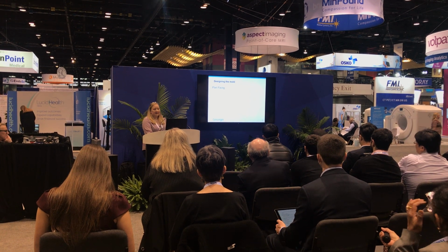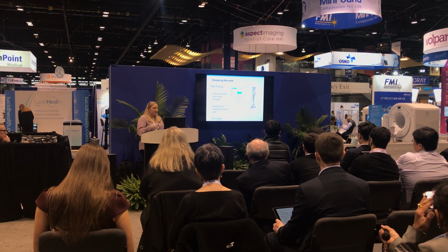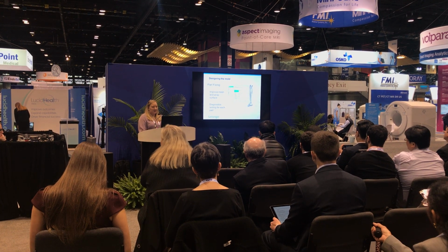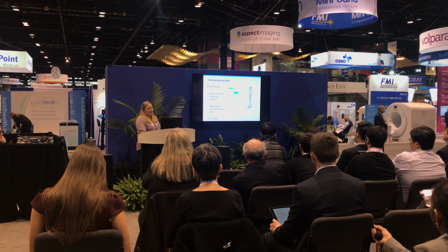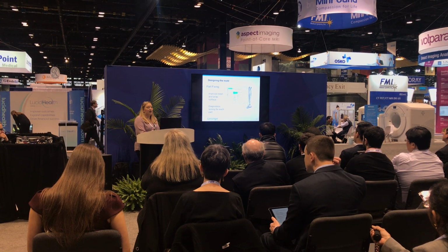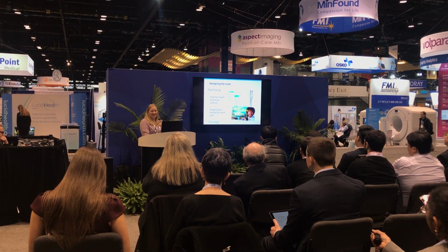Part fixing is also the same. So this is when you improve your mesh, you wrap your surfaces, you're gonna run a diagnostic test for each print. And as you can see, I always say when you have all green check marks, we Bob Ross it, so we make happy little marks.